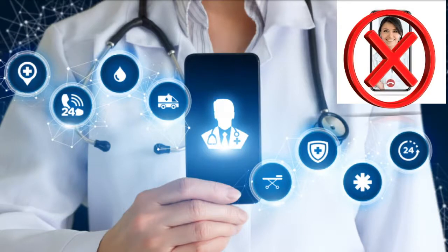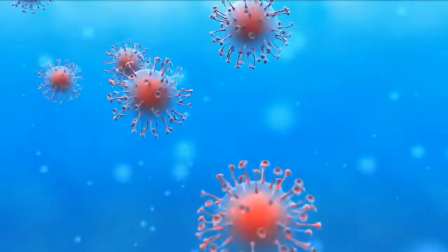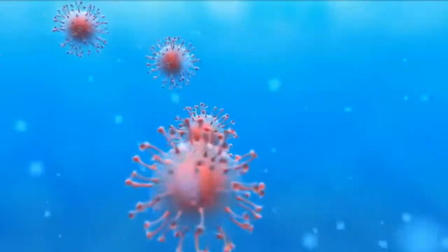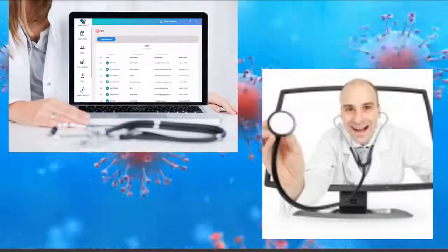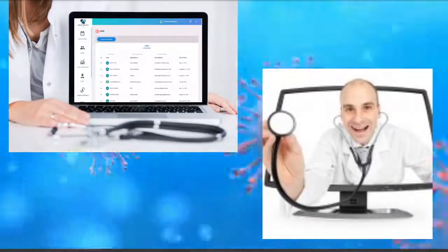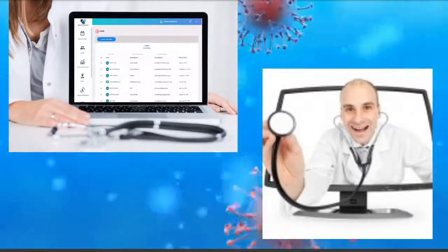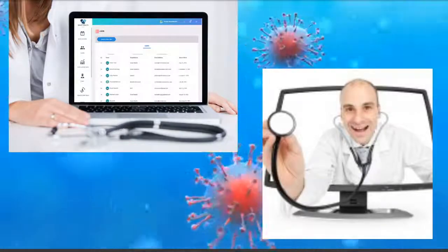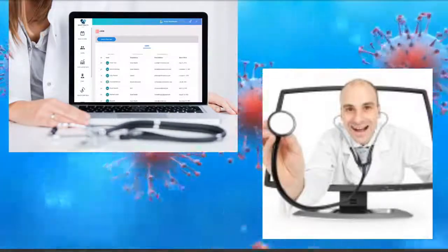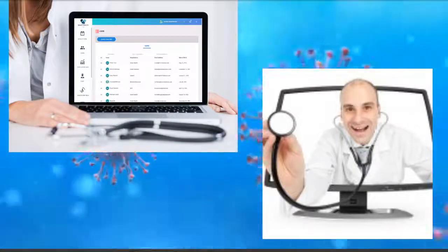Both parties have the ability to turn the video portion off, and also both parties have the ability to redirect the camera outward so the device camera may be utilized to position it to show a wound or movement from a body part. Due to COVID-19, the regulations changed so physicians can bill for telehealth services without the traditional face-to-face and sign-up procedure. The physicians have been using our platform for RPMs as well as telehealth.